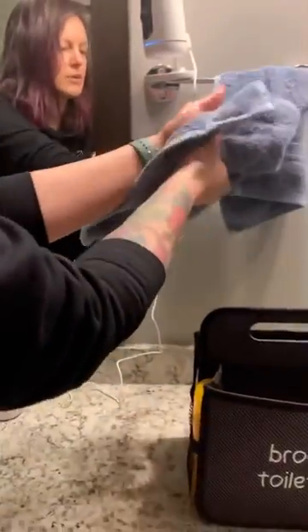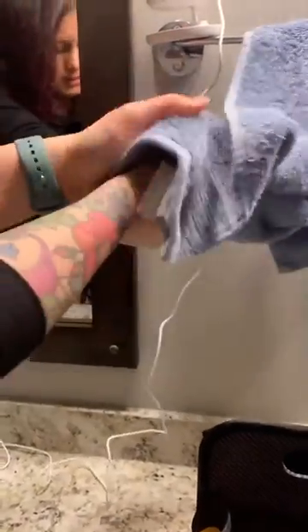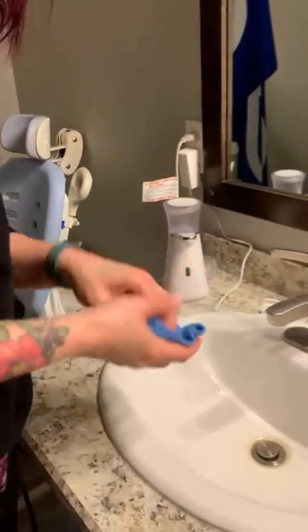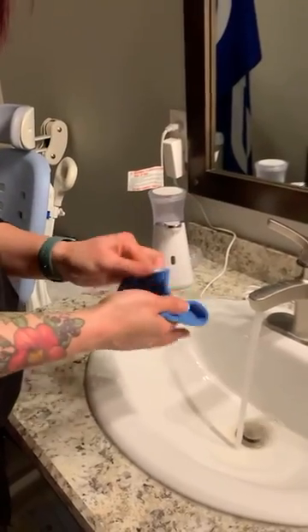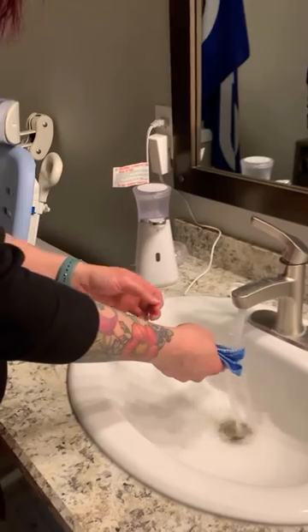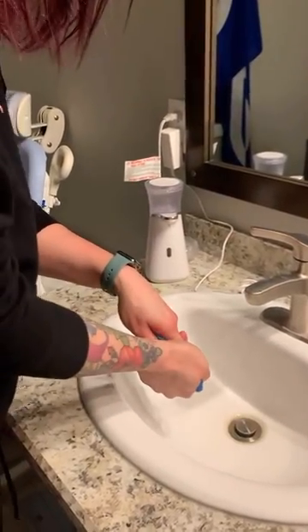I just changed this towel so I know that it's clean, but if you want, you can get a brand new towel. Okay, so we have this small washcloth, and I'm going to just wet one part of it with not scalding water, but like on the fairly warm side. Okay. And then, see, part of it's still dry.